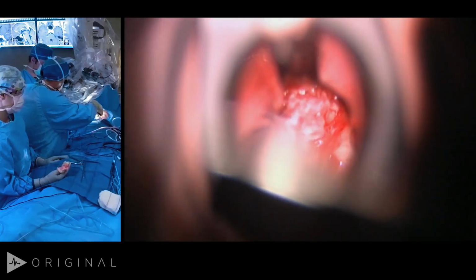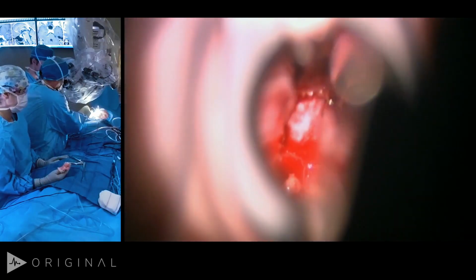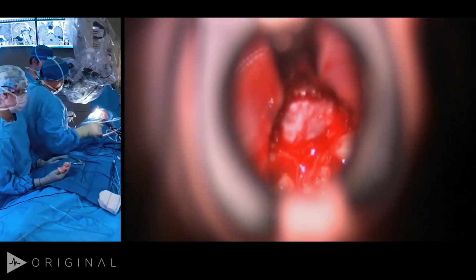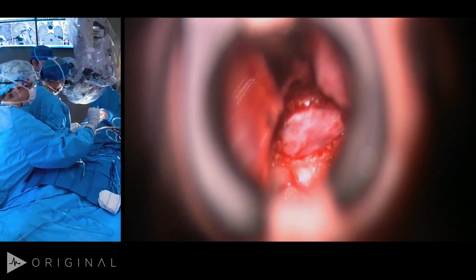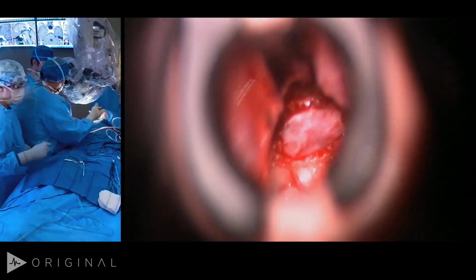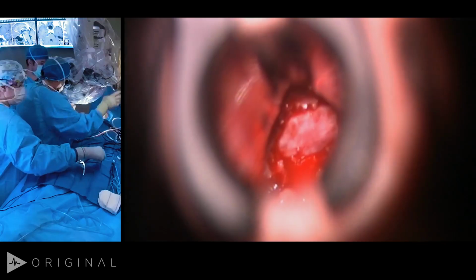But as I had commented earlier, her MRI is a little unusual, where there appears to be some extension of this tumor across the midline. So I really do want to have a good exposure. Very rarely you can find a patient with multiple microadenomas. So that's looking pretty good, the angled Kerrison. You can see there are some venous channels in the dura, so we can anticipate that there'll be some bleeding as soon as we open the dura. We'll work around that.